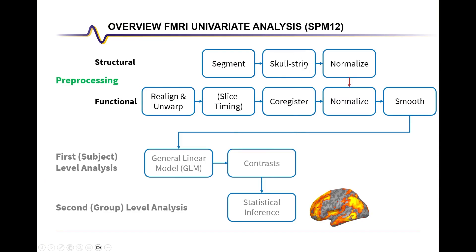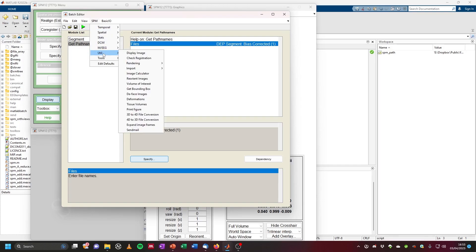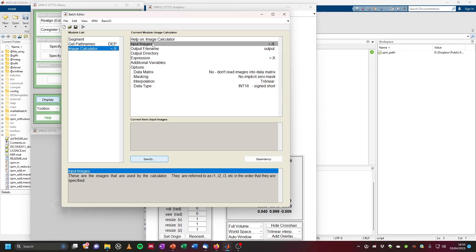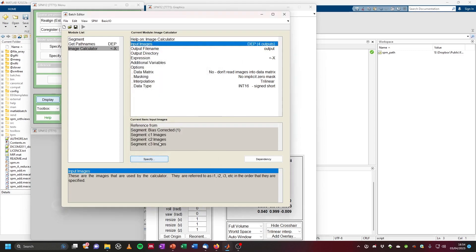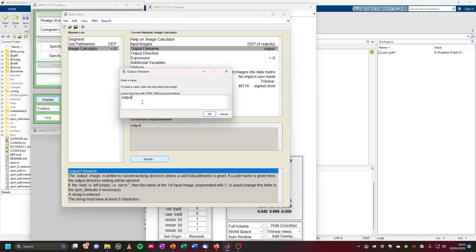As the next step, we are going to perform skull stripping. For this, we go to SPM util, image calculator, then click on image calculator. As the input images, we use a dependency again — right click on input images, then choose the bias corrected image. Hold down control and also select the C1, C2, and C3 images. C1 is gray matter, C2 is white matter, C3 is cerebrospinal fluid, then click OK. As the output file name, enter something like skull_stripped_bias_corrected_t1.nii.